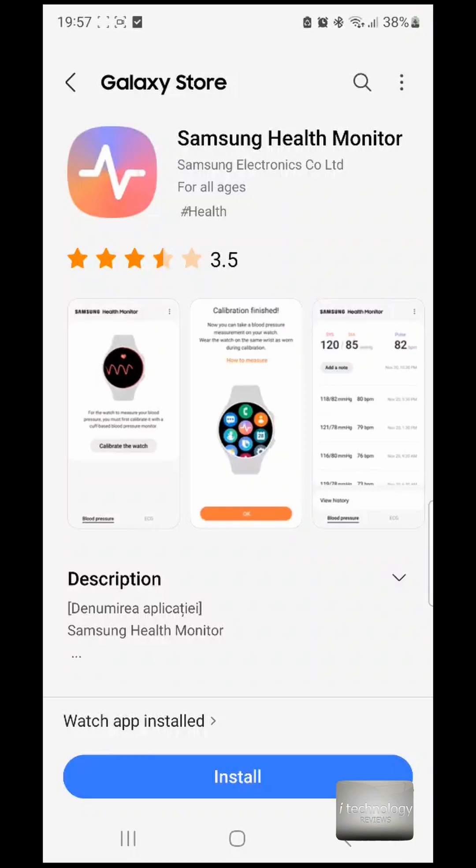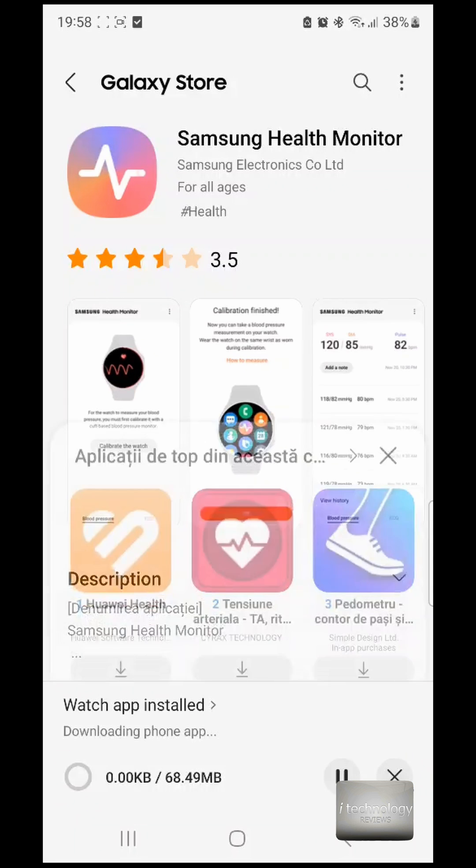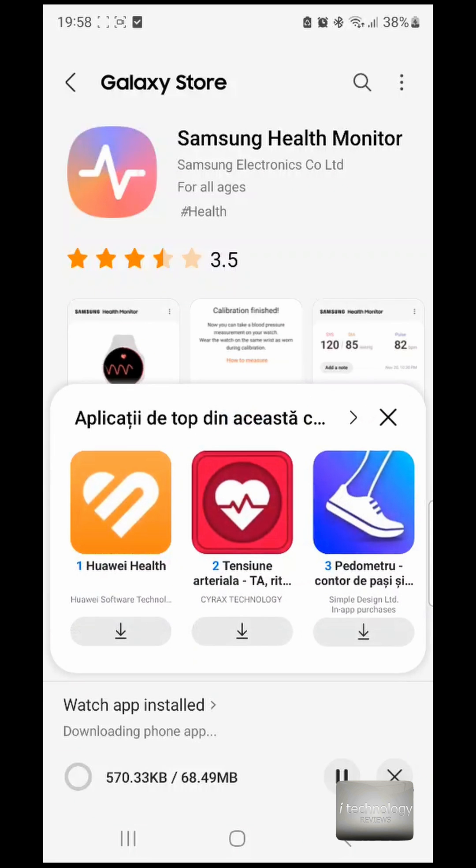I've clicked it and Samsung Health Monitor appears — it's through the Galaxy Store. But as you saw, I searched the Galaxy Store before and it didn't find it. Maybe it's a technique from Samsung to hide it from users who don't have Galaxy smartwatches.